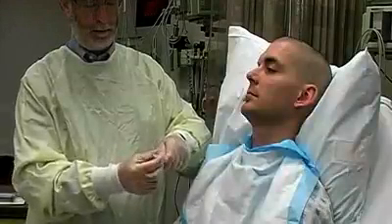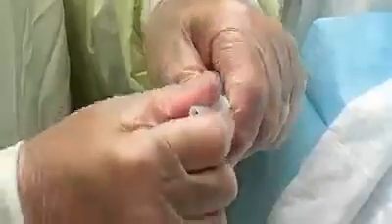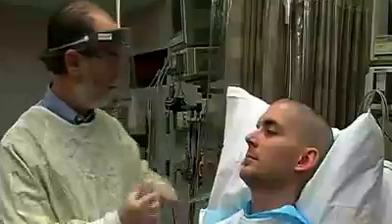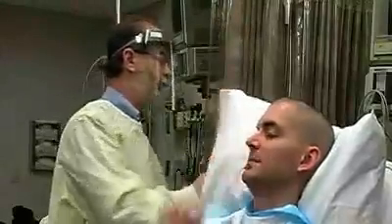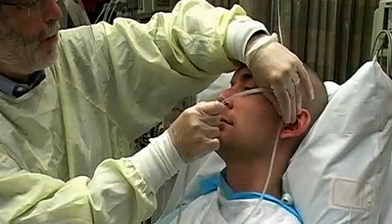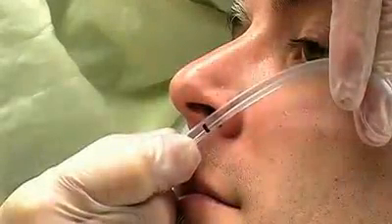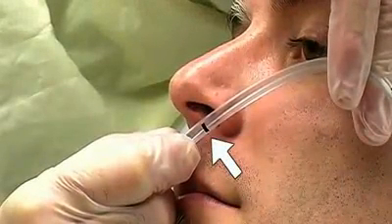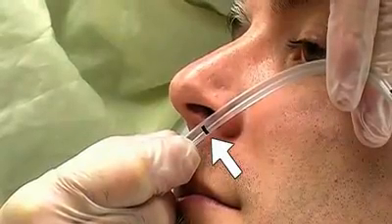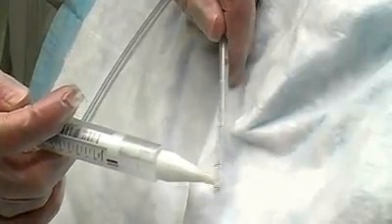Next, prepare the nasogastric tube. To keep from losing the suction adapter supplied with the tube, remove it from the nasogastric tube and insert it into the suction tubing. Place the suction tubing behind the patient's pillow so it is within easy reach. The proper depth of insertion is roughly the distance from the xiphoid process to the ear and then to the nares. Note which of the black marks inscribed on the tube corresponds to the appropriate depth. You'll insert the tube to that mark. Lubricate the tip of the nasogastric tube with either viscous lidocaine or surgical lubricant.